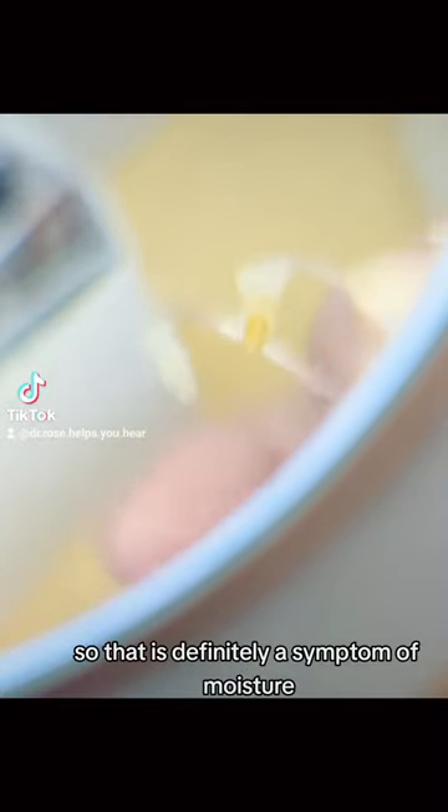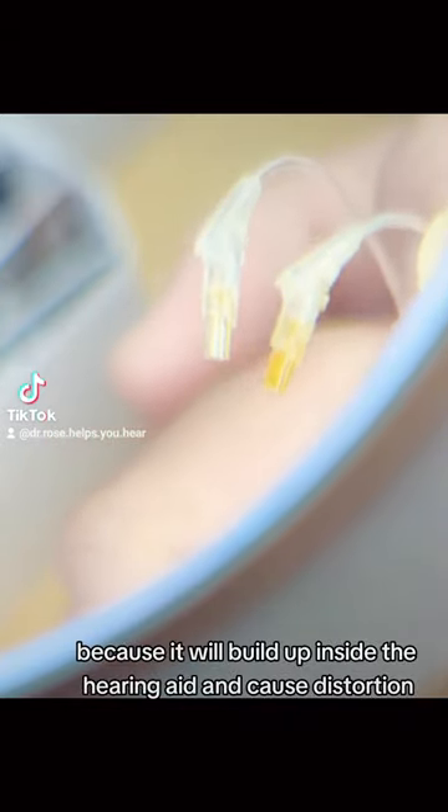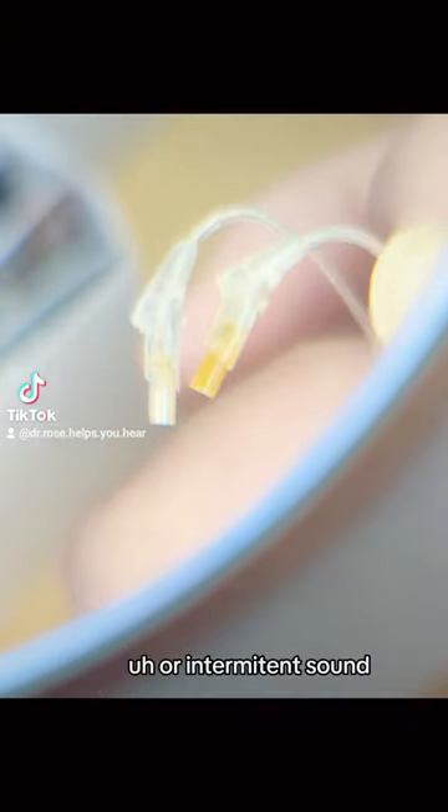So that is definitely a symptom of moisture, and we want to take care of that because it will build up inside the hearing aid and cause distortion or intermittent sound.